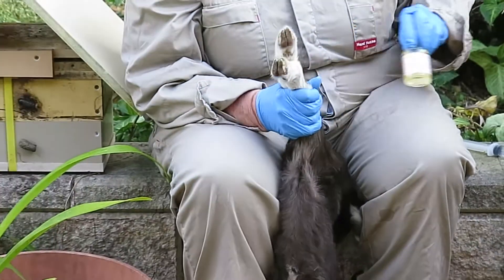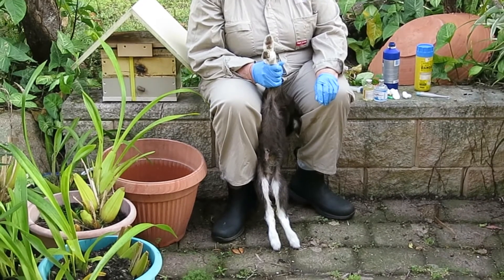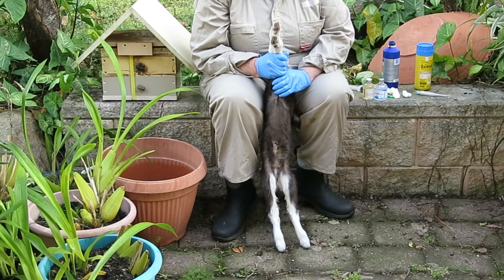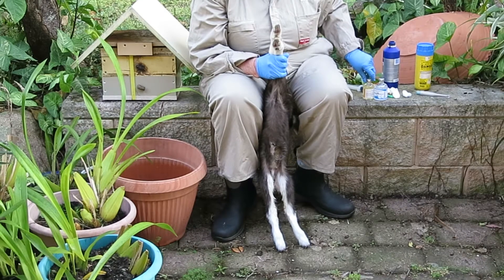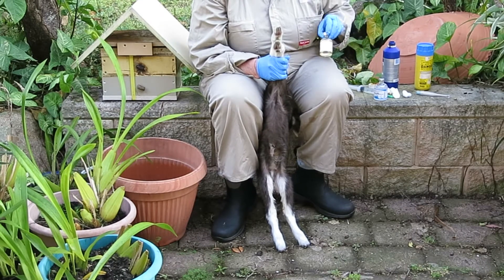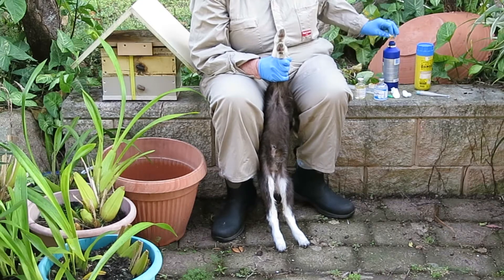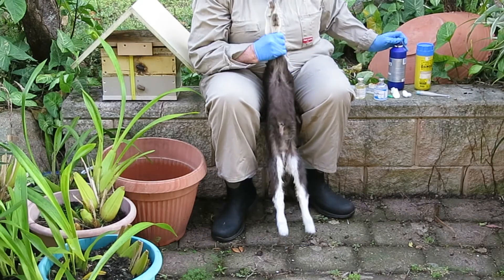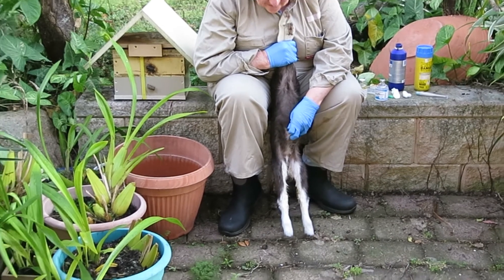You can buy either a 40 or 50 percent glucose solution and some sterile water. You make up a 20 percent solution by taking some glucose and adding sterile water, then you work out a dose. The dose is 10 mils per kilogram of a 20 percent solution.